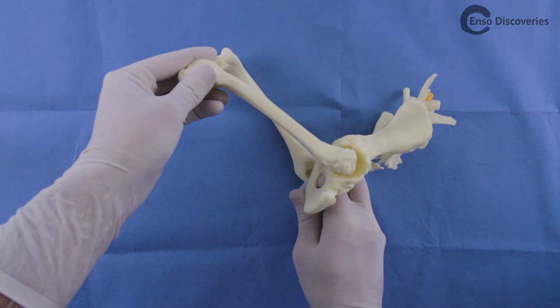You can also have your assistant apply some gentle traction to the stifle — that is, pull the femur away from the pelvis. In an anesthetized or heavily sedated animal, you can distract the joint an appreciable amount.